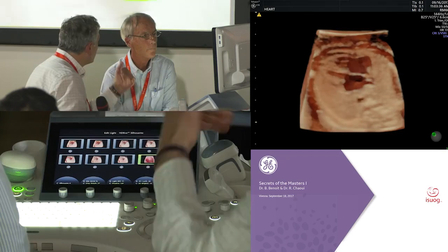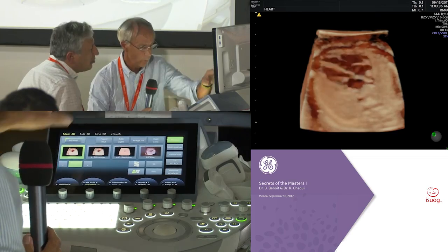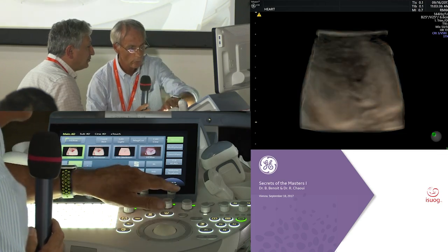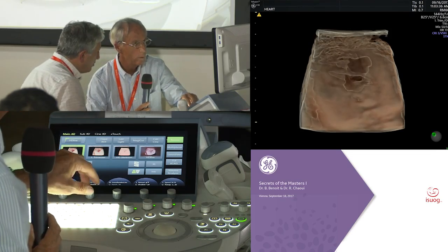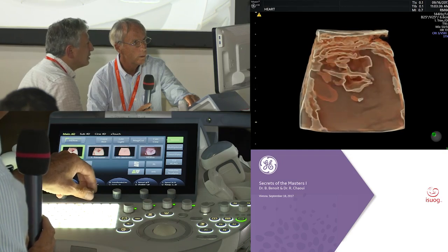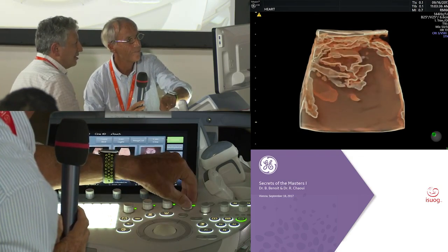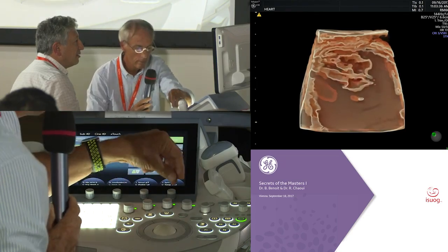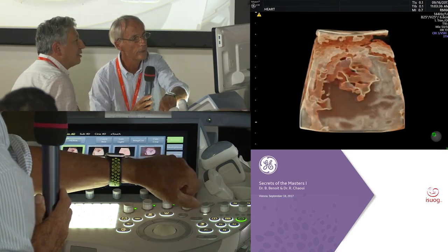And then, now show me your trick. So again, you go for yes, but I don't know if it will work, but we will try. First, silhouette, we put it to 100%, reduce transparency, okay, and gray to 0. Threshold. It should work. Yes, it's nice. Oh, we can see the two atria, pulmonary vein. And then the aorta and the pulmonary artery.